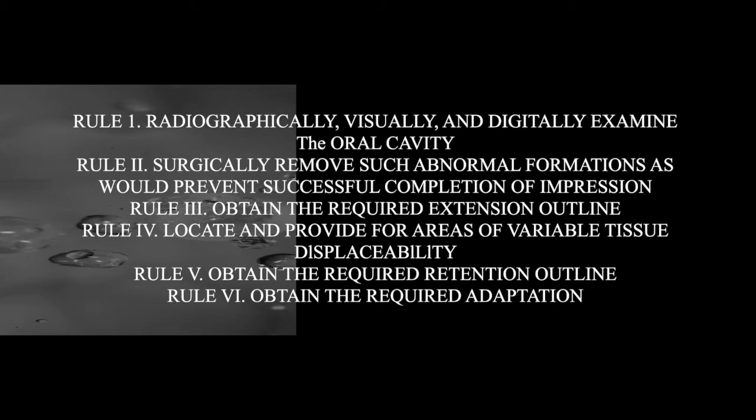Rule 4: locate and provide for areas of variable tissue displaceability. Particularly, Rule 4 is for maxillary impression taking. Rule 3 is meant for mandibular impression taking. In Rule 5, obtain the required retention outline form. And Rule 6, obtain the required adaptation form. So these 6 rules are required for ideal impression making.